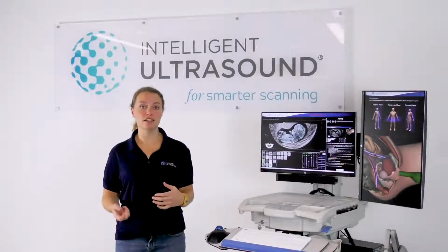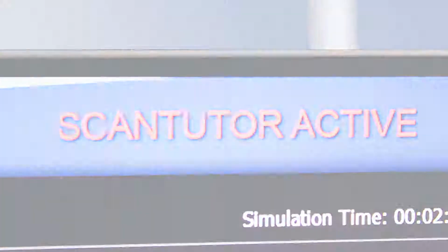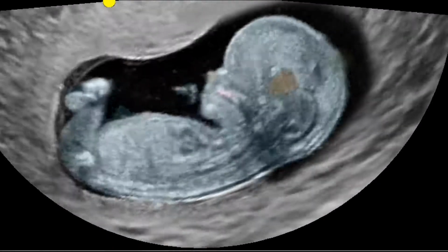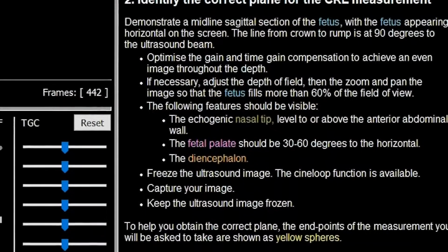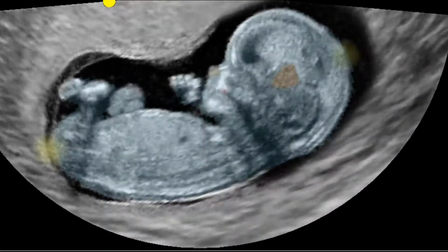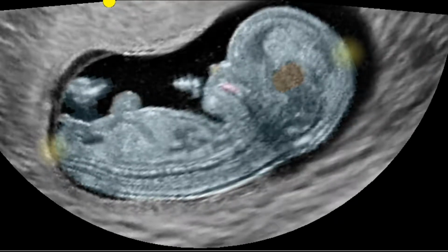As mentioned earlier, while in practice mode there is an inbuilt tutor, ScanTutor, which helps with the task being performed. ScanTutor helps in 4 ways. First, by colour-coding relevant structures on the ultrasound and in the task instructions. For example, in this task we can see that the structures highlighted are those needed to achieve the correct plane for the crown rump length measurement.